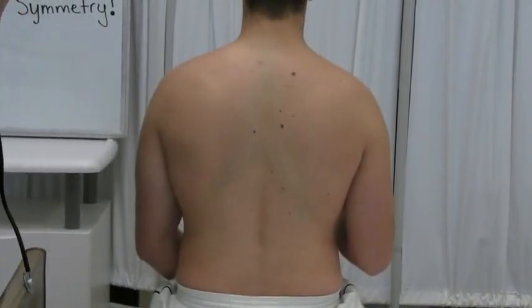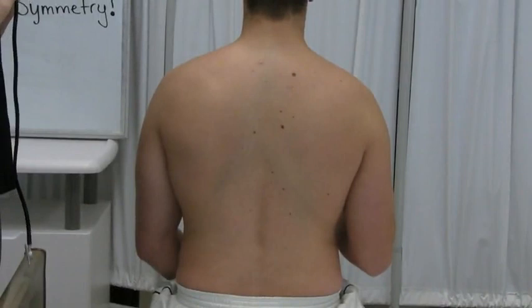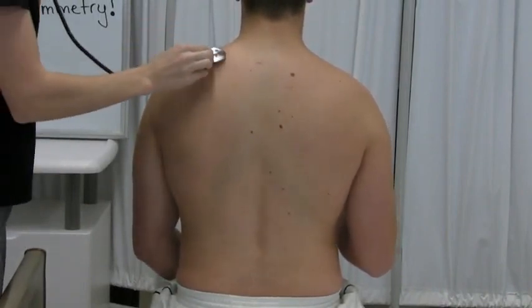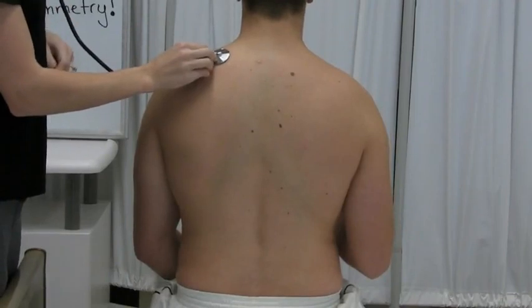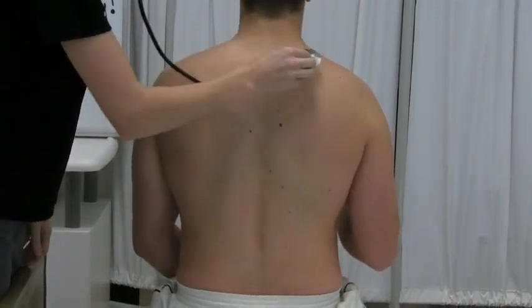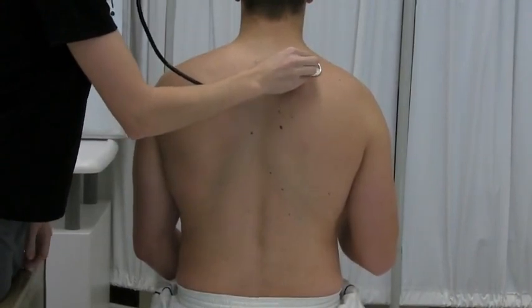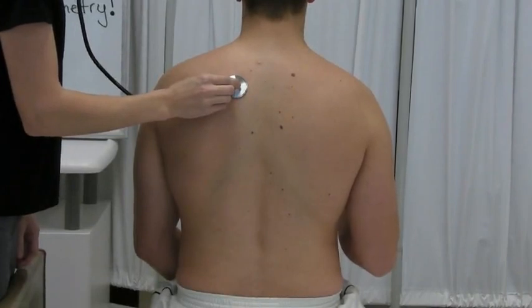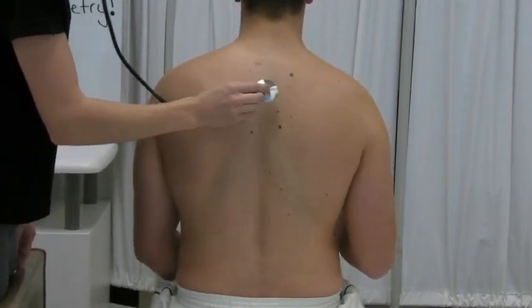So Lee, I'd like you to take a slightly deeper breath than usual and breathe through your mouth. Listen to one complete breath cycle in each spot and compare from one side to another. You don't want to be directly over the scapula because the bone would decrease the sound transmission.